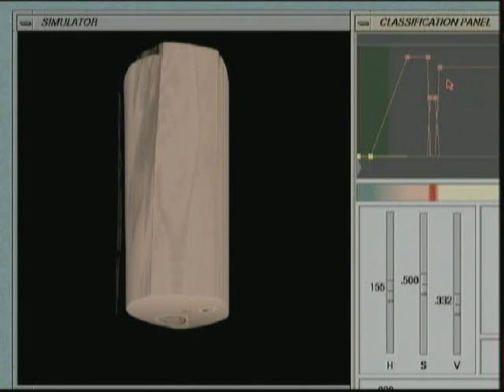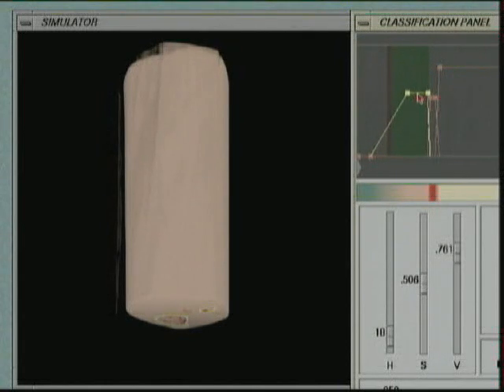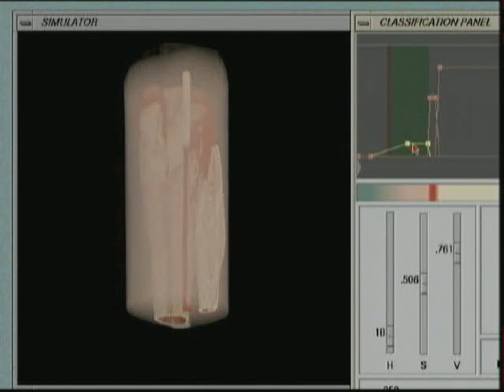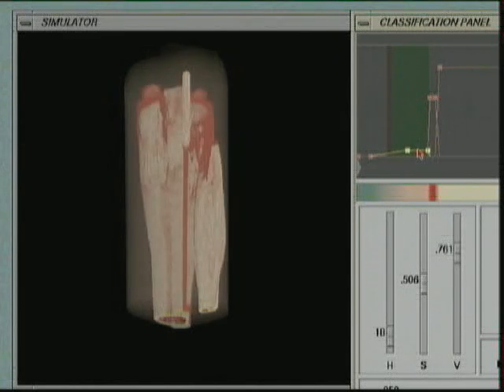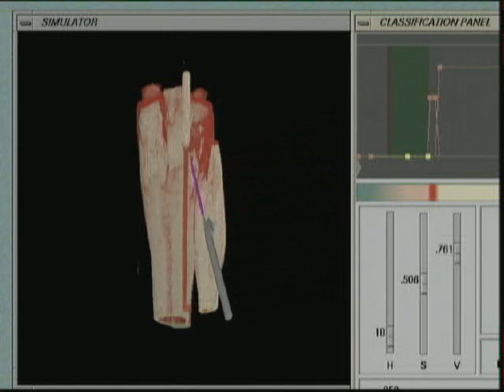Here, three types of tissue — bone, vein, and muscle — are given non-zero values. Bone and vein are hidden behind the muscle. The physician now reduces muscle opacity in order to see the vein, whose position may slightly vary according to the patient. He then deletes the muscle in order to perceive the haptic consistency of the vein.